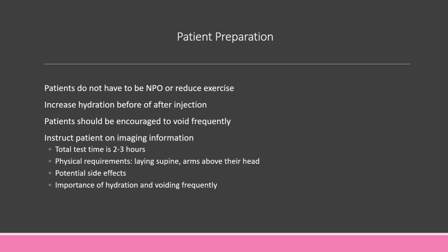And then instruct the patient on imaging. So the total test time will take about 2 to 3 hours. Physical requirements include having the patient lay supine with their arms above their head. Any potential side effects, recall that loss of taste that's temporary is probably one of the most common, and that occurs in less than 1% of patients. And then stress to the patient the importance of hydration and voiding frequently.